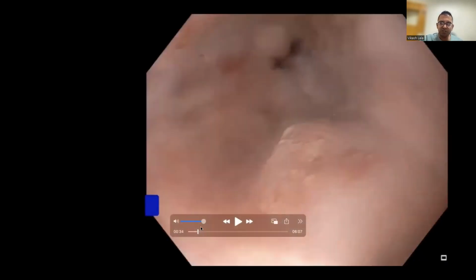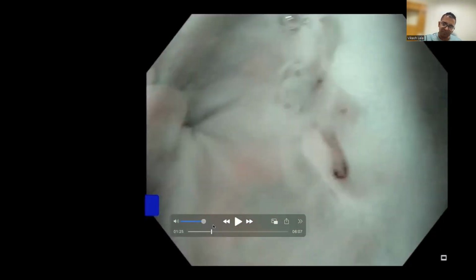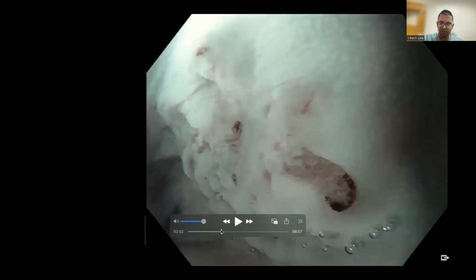So I then proceeded to do a closer look with image enhancement. And here I did have near focus. So I actually put it underwater. And what you can see when I put it underwater is it actually floats that lesion up and makes that bulkiness more apparent. So now you can see that little donut staring out at you a little bit more. Within that area, you're seeing an area here which clearly is irregular. There is no nice mucosal and vascular pattern, but there still is some vessels. So I call this an irregular area with some maintained structure. So I thought it was an early adenocarcinoma. And certainly, I think this is just the tip of the iceberg, and the whole bulky area represents actually adenocarcinoma.